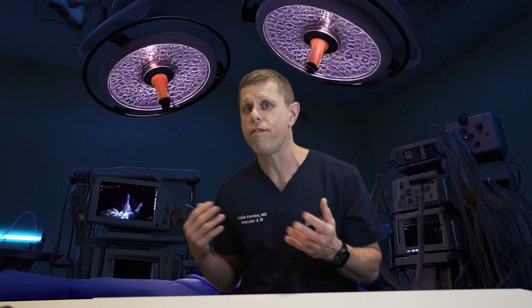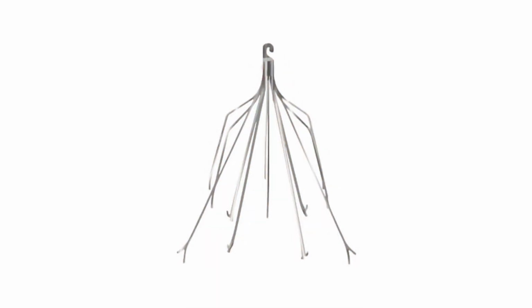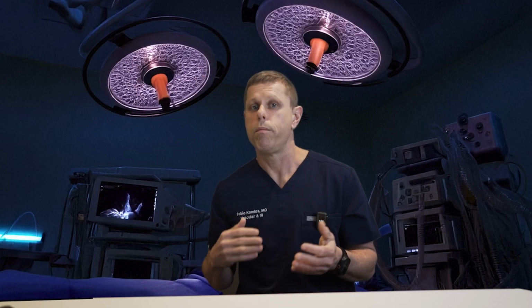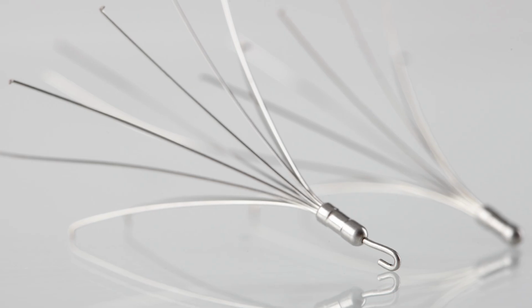But like any other procedure, there are obviously risks associated with the IVC filters. The most infamous risk is a risk of filter migration. You see, the legs of the filter usually have little hooks that maintain the filter in place. Migration means that you put the filter in one place and then with the activity, it would move to a different place. The worst case scenario would be moving to the lung. But although this is a potential risk and has been described in the past, quite frankly, with the new filters, I have not seen this happening. I have seen it with older filters, but not with the new ones.